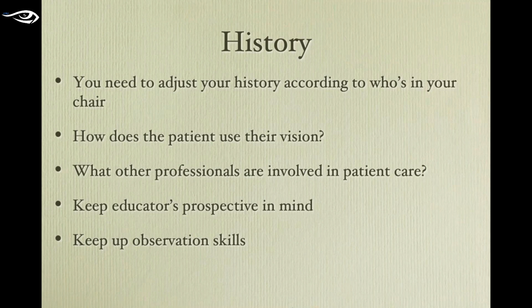And believe me, it's happened to me many, many times. So I like having a desk in front of me and the patient, something to protect me a little bit. And I do my Brückner and I do my retinoscopy at a distance, and I do other kinds of testing at a distance, and I try to do the best I can. And if I find that I'm able to get what I need, then I'll come closer.